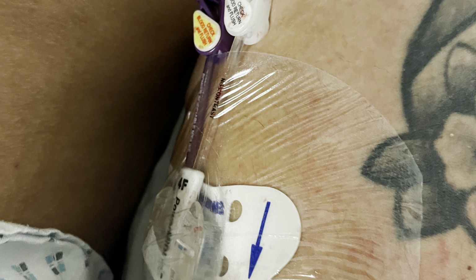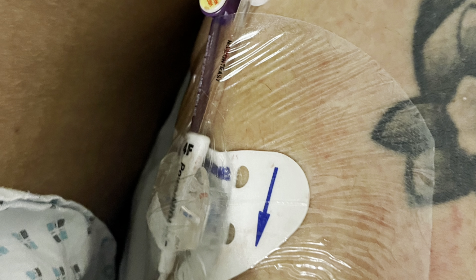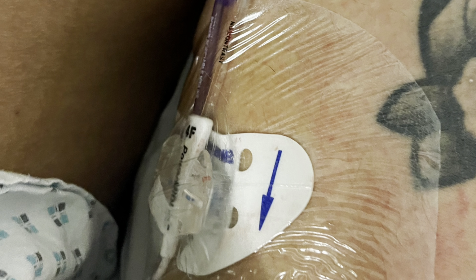If resistance is met, stop, as this may be due to vasospasm. A heat pack can be applied for 5 minutes prior to resuming. If resistance still occurs, seek help.